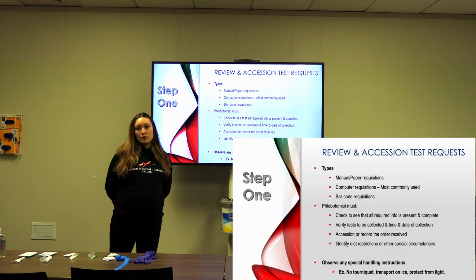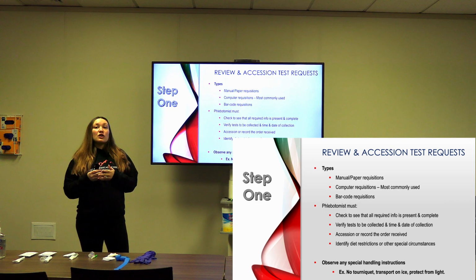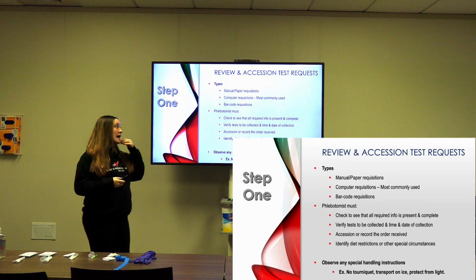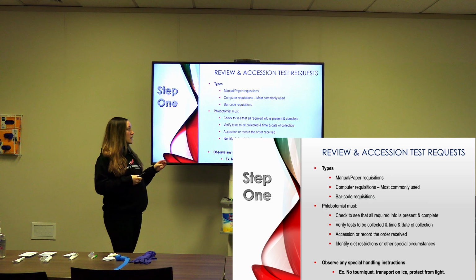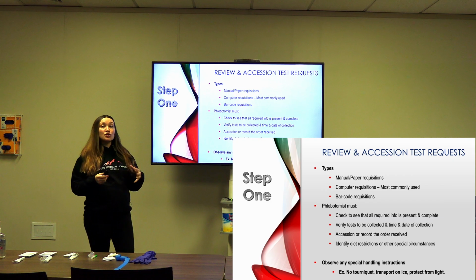Sometimes doctors and nurses will put in multiple tests across multiple days. So just make sure that you're paying attention that the test that you are taking is for today and now. Okay, so check the date and time and make sure that it's the correct date and time for the test to be collected. Accession or record the order received. Identify diet restrictions or other special circumstances.